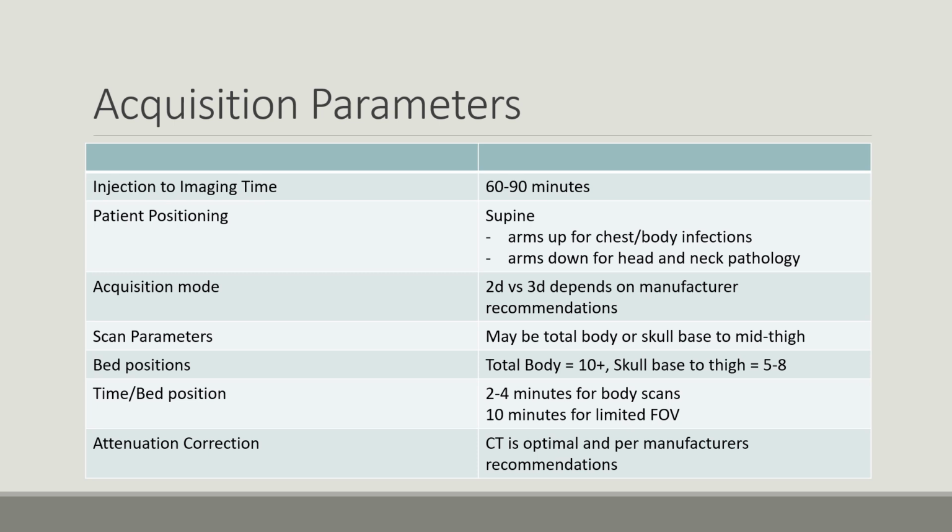These are the acquisition parameters. So the uptake time is about 60 to 90 minutes. Position the patient supine. If the suspected infection is in the chest or the body, you may be able to bring their arms up above their head and scan them from eyes to thighs.